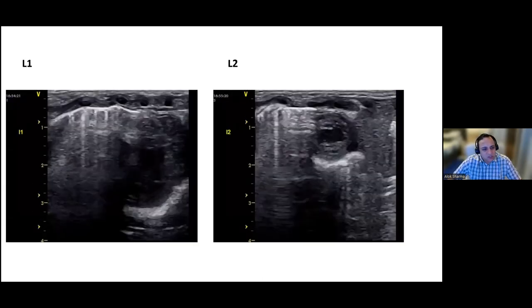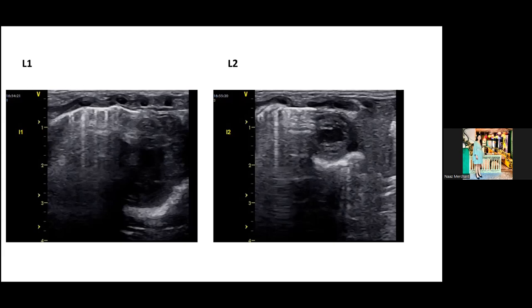What did you think your diagnosis was? So initially, with the initial x-rays and the ultrasound, which we did, which just showed B profile basically everywhere and columns, it was initially RDS. I mean, clinically we thought it could be RDS or TTN. But the fact this baby recovered so quickly, within 8 hours, just makes us wonder whether. Did you have subpleural consolidations in that first?